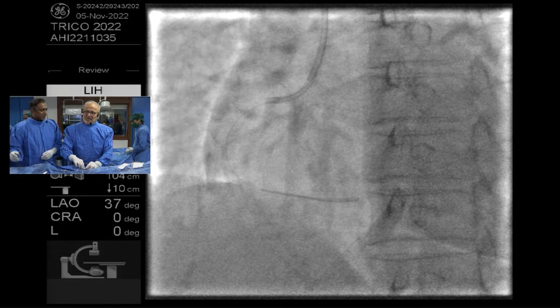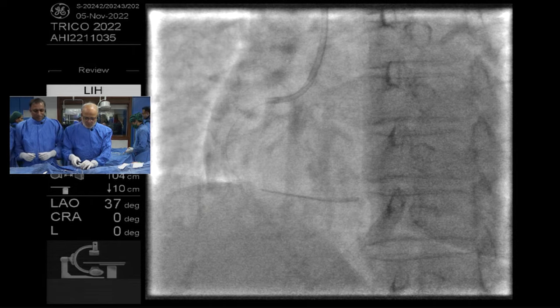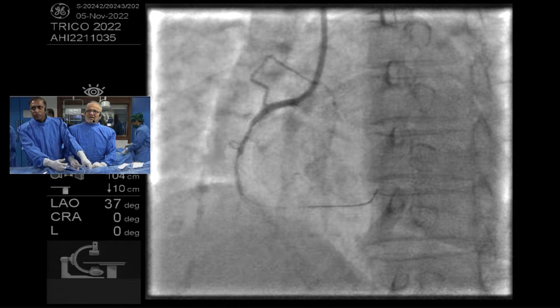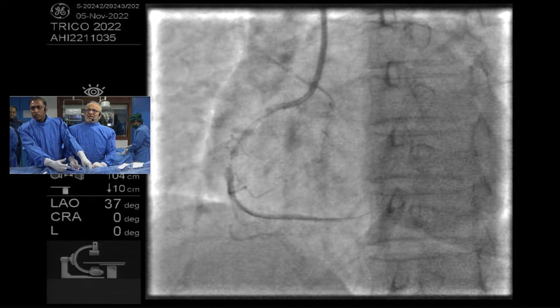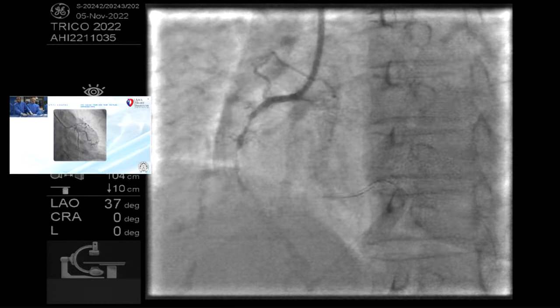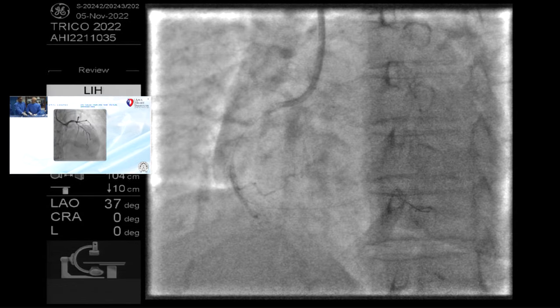The plan is to image this and then re-stent. First I'll dilate properly and then image, because in-stent restenosis is a completely different ball game. OCT has taught us a lot about in-stent pathology. I will dilate with a 2.5×15 balloon.